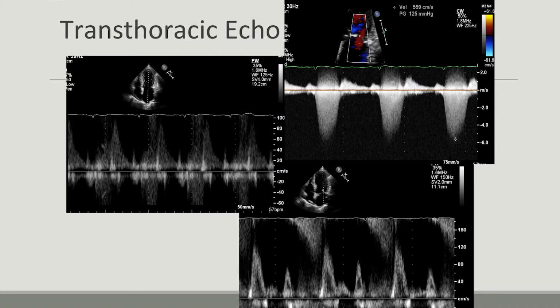On the left, we see the pulse wave of our pulmonary veins. Because of the color image before, I expected to see systolic reversal, and there it is. A pulse wave at the mitral valve tips is also important to see if there are increased E-wave velocities.